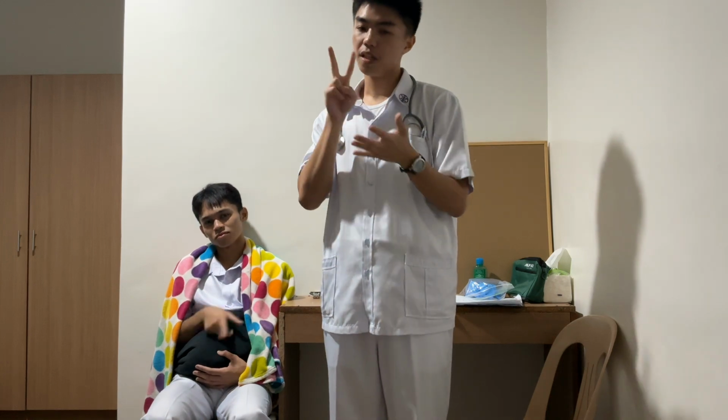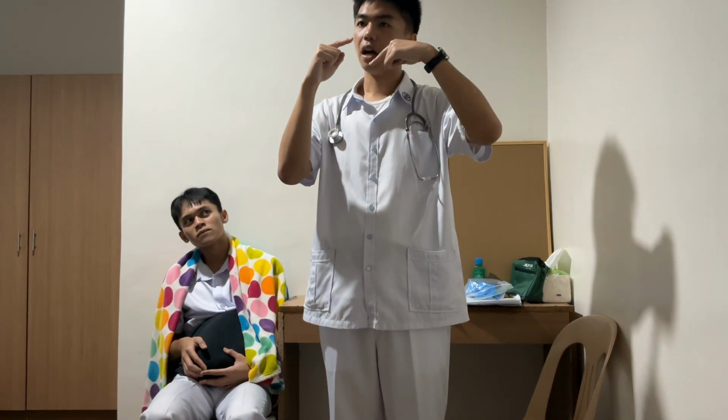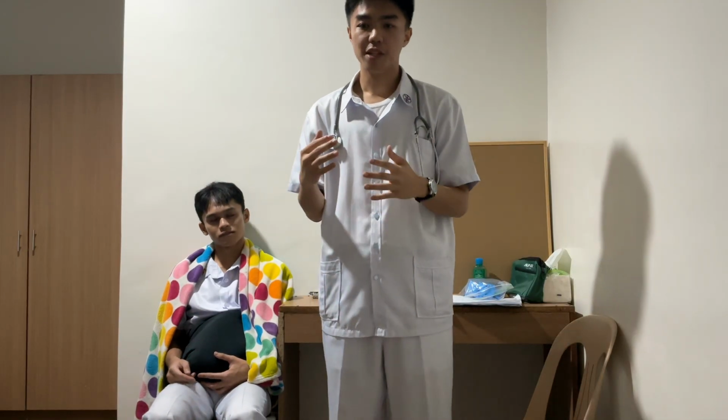After the 2, if we see a large gap between the 2, we can take it again. And then if we still see an abnormality, we can average this and get the mean of this one. We get the average, and that will be the blood pressure of the patient.